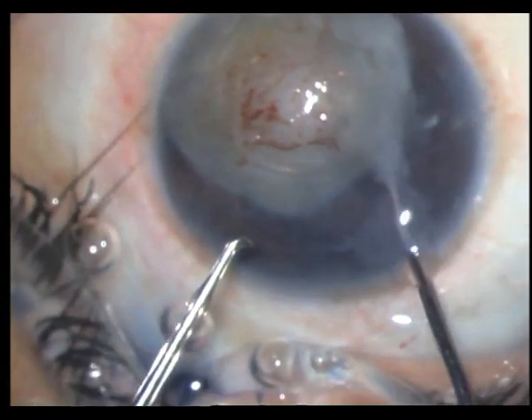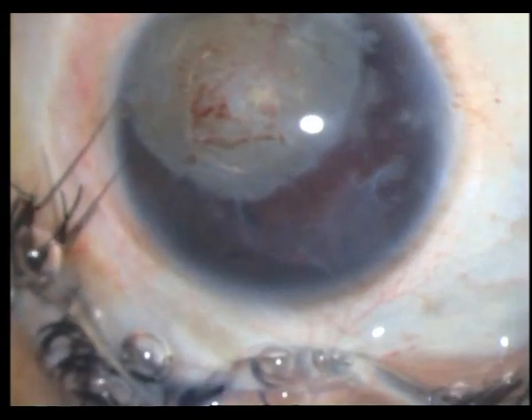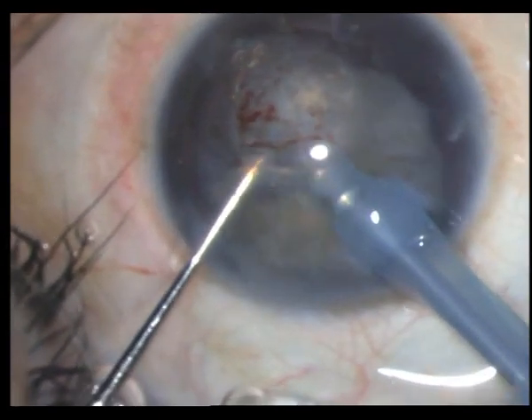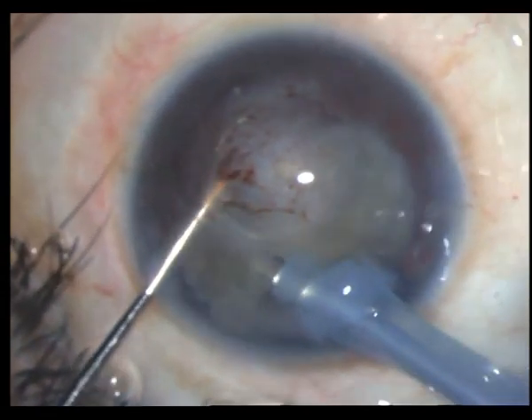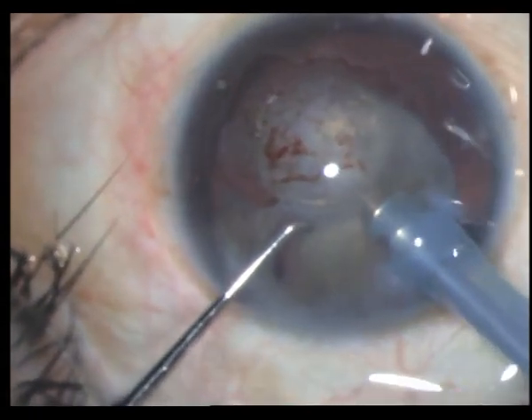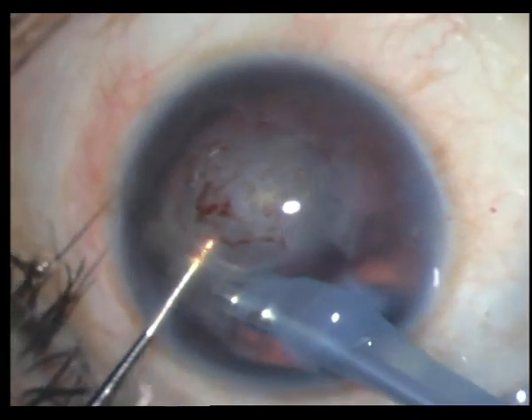I have been mentioning quite often that there is a pathological myope — the anterior chamber is extremely deep, so there is no problem. I bring the nucleus out into the anterior chamber, and then it's a very soft nucleus: I just take out the whole nucleus in a block. There is no fear of any tags extending. If you do this in the bag, a can-opener probably can extend and it's not a good idea because you can't even see it. And there — I have got the nucleus out.